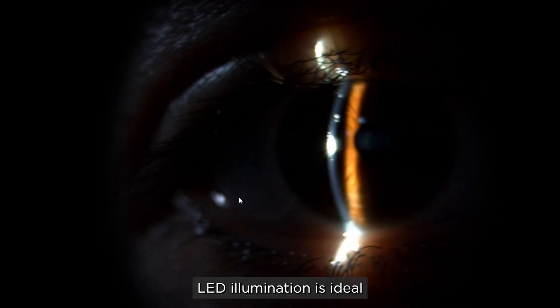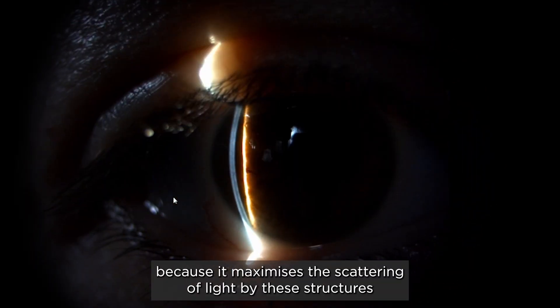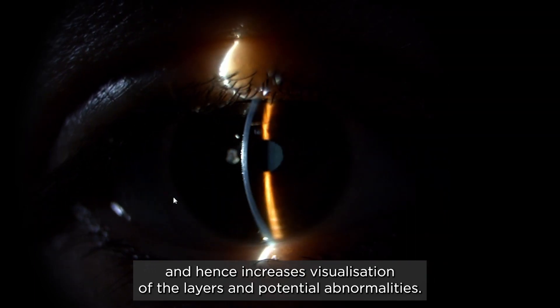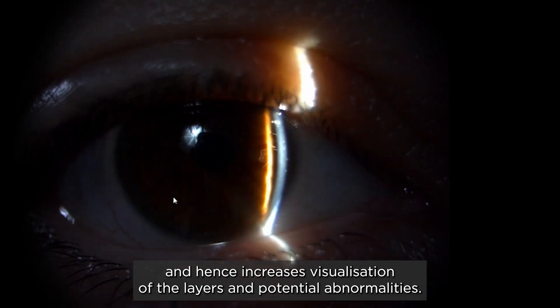LED illumination is ideal because it maximizes the scattering of light by these structures and hence increases visualization of the layers and potential abnormalities.